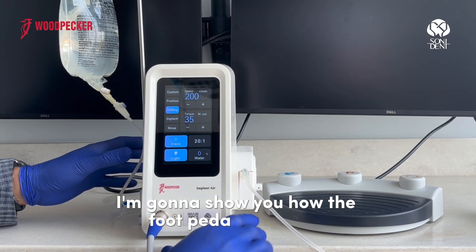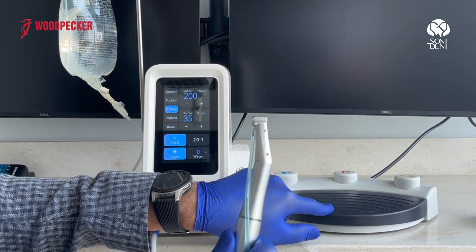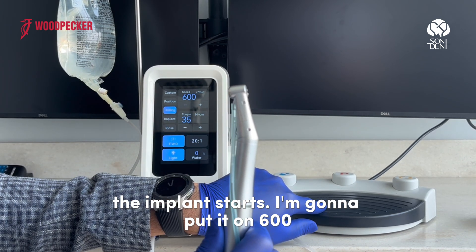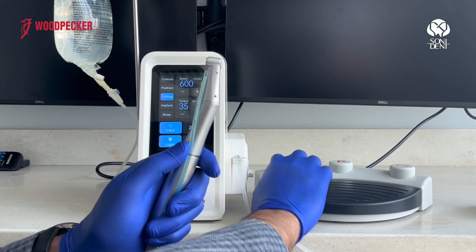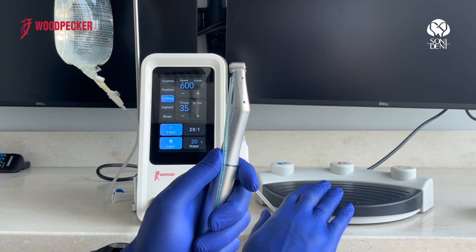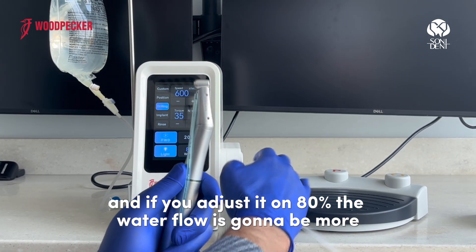Here I'm going to show you how the foot pedal works. Whenever you press the pedal, the implant motor starts. I'm going to put it on 600. By pressing this button, you can adjust the water flow — if you set it to 80%, the water flow is going to be more.